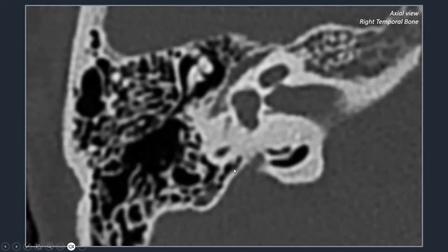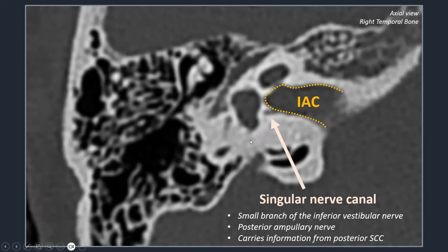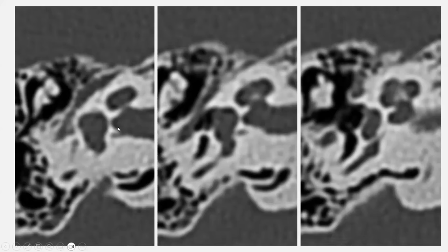Another structure not to confuse with pathology is the canal for the singular nerve — a small branch of the inferior vestibular nerve also called the posterior ampullary nerve — which courses through the posterior semicircular canal and carries information specifically from it. On consecutive CT images, the canal for the singular nerve can be followed from the internal auditory canal to the posterior semicircular canal.